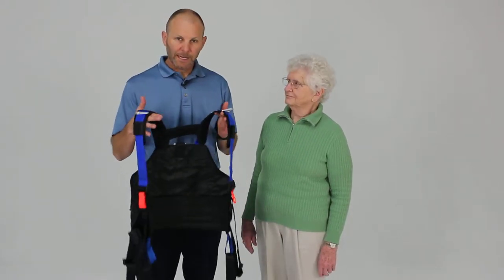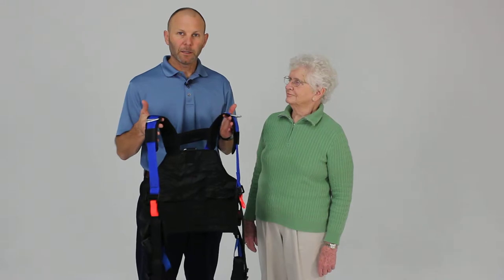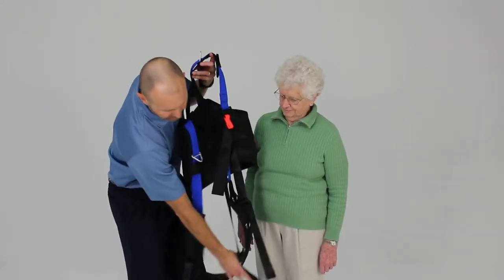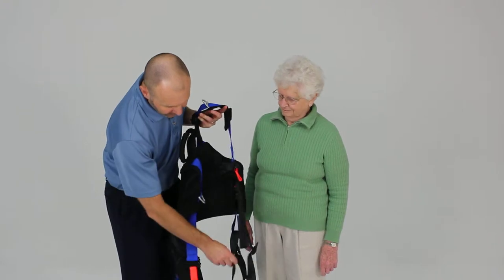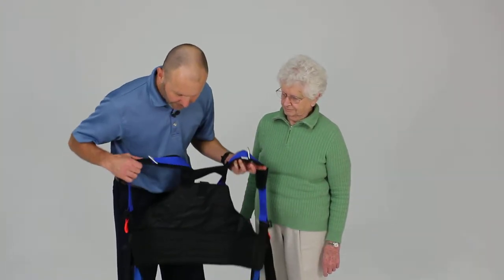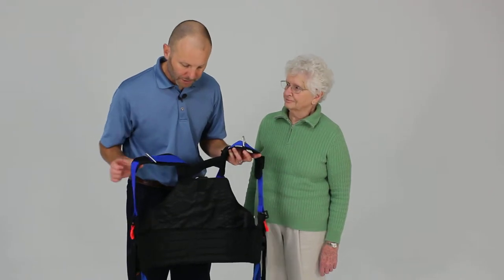When applying the balance harness in a standing position, one way that can make it a little bit easier is to go ahead and pre-position this pelvic support strap by threading the ends through these blue loops, so it's just hanging there in place prior to application.